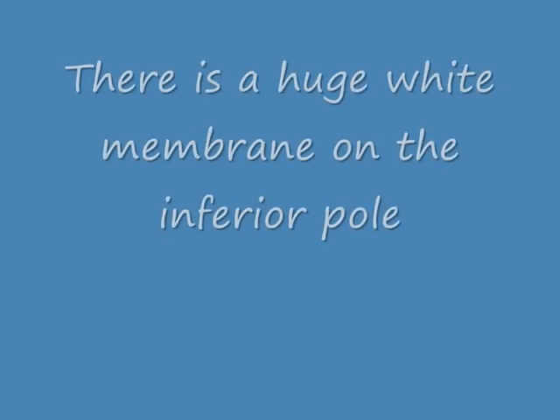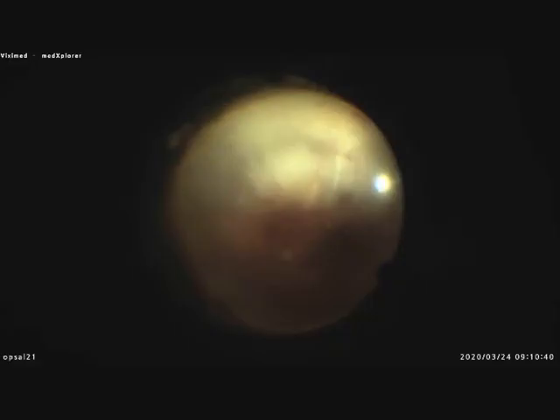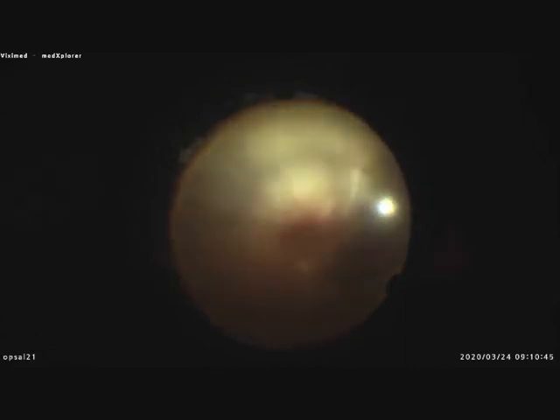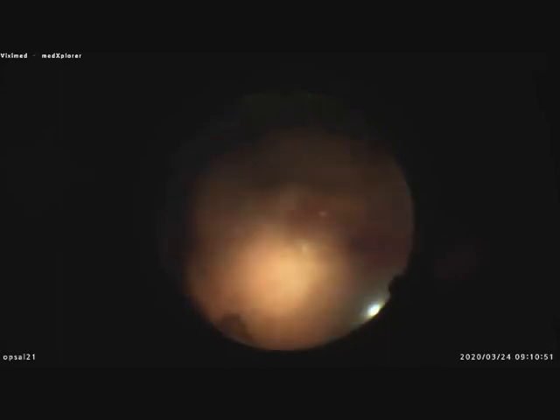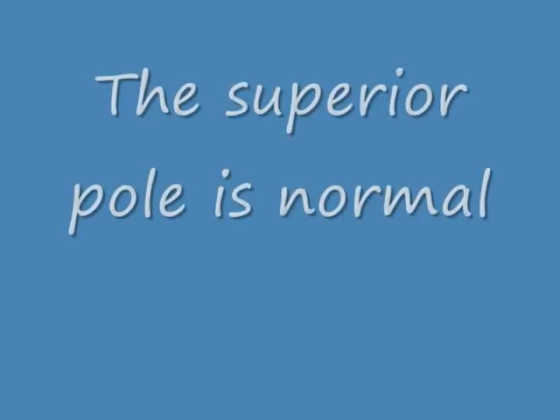Now comes the interesting finding on this video. Please observe the white retina at the inferior pole — the complete inferior pole is covered by white tissue. The superior pole is normal, and there are some hemorrhages at the central pole.